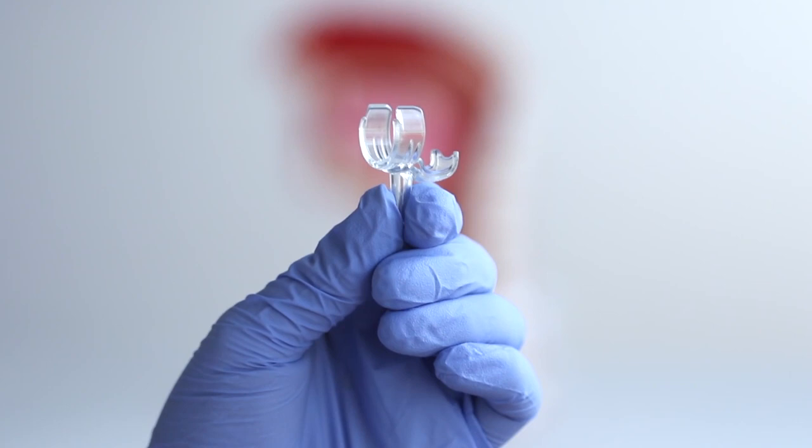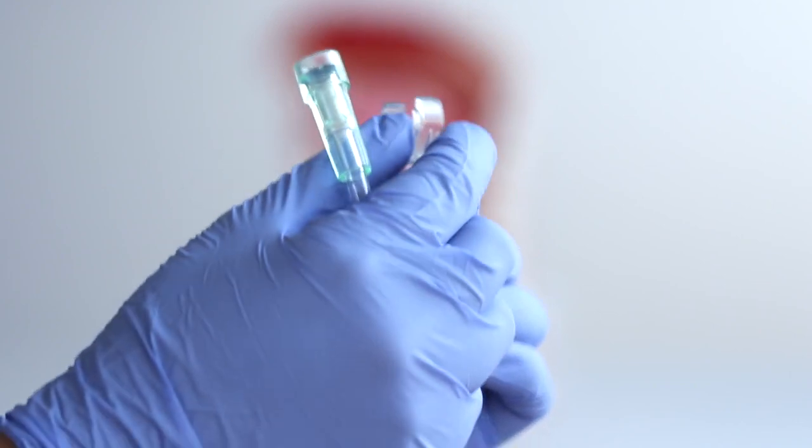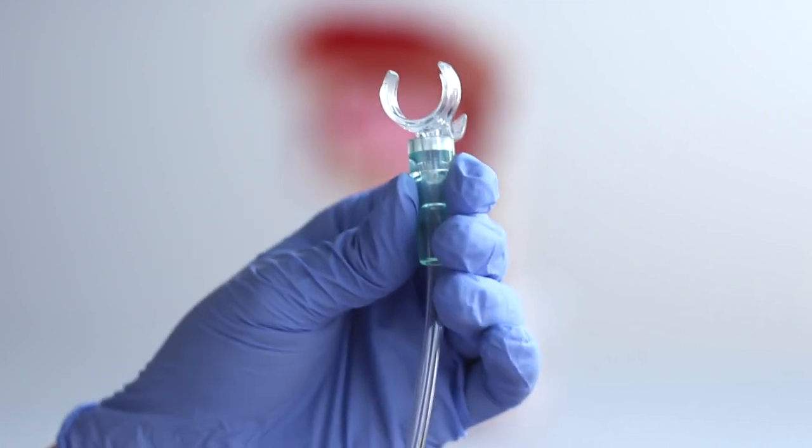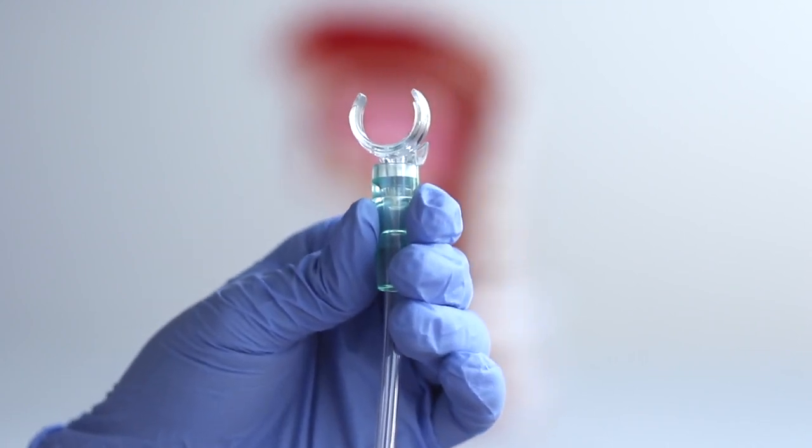Oxygen connection tubing is attached to the inlet of the adapter and to a low-flow oxygen source. Oxygen flows to the inlet of the adapter and is then directed in front of the valve to be delivered to the patient during inspiration.